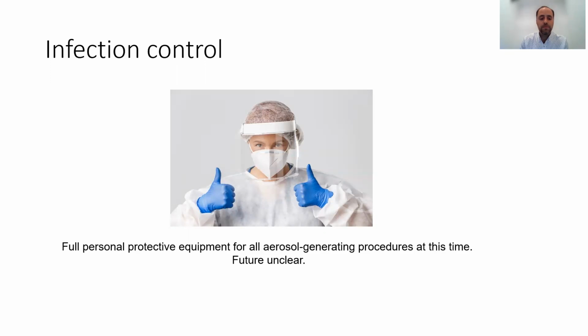At this point in time, proceduralists are required to wear full personal protective equipment for all aerosol-generating procedures like flexible bronchoscopies. The future of our protective equipment will be determined based on the future of the COVID pandemic.